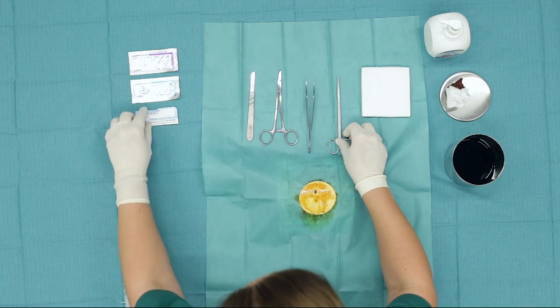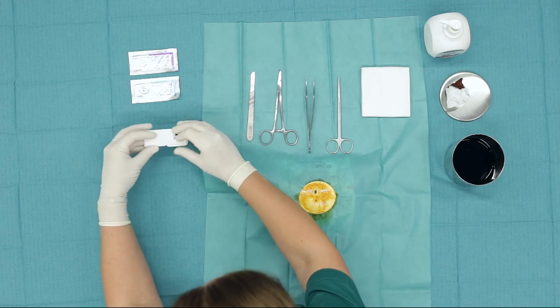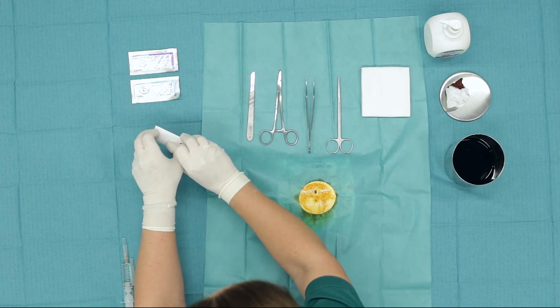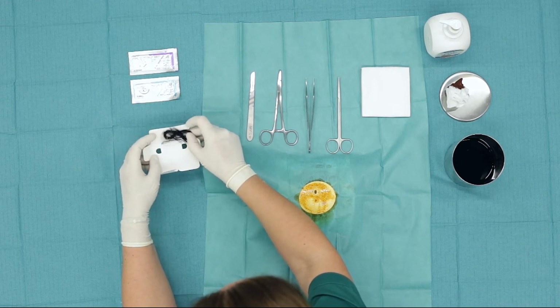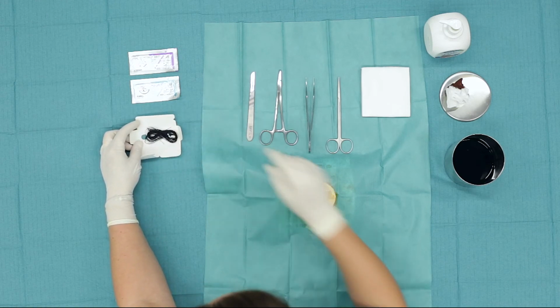Other stitches that I can generally use are the simple ligatures, as in this formulation here. They do not have a needle, but they are just stitching that we use as ligatures.